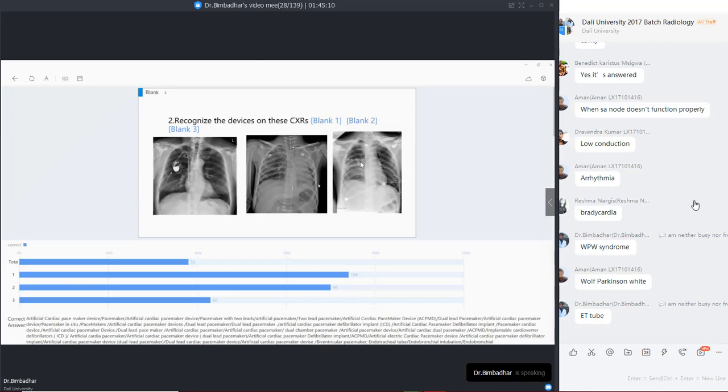This one is a chest drainage tube, which is generally done for the decompression of pleural effusions, for the extraction of the pleural effusion. After you have done the thoracentesis procedure, you will be placing a tube inside so that the collapsed lung and all the fluid that has accumulated can be collected back. Okay, so this is a chest drainage tube.